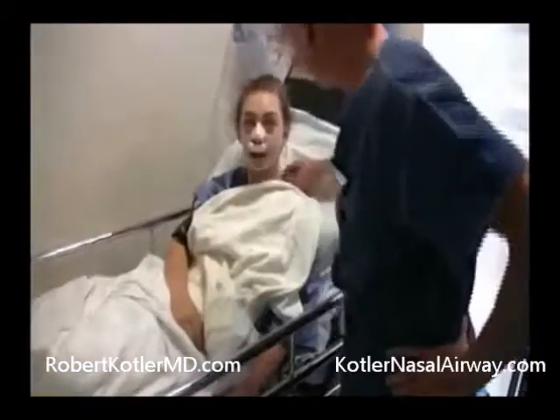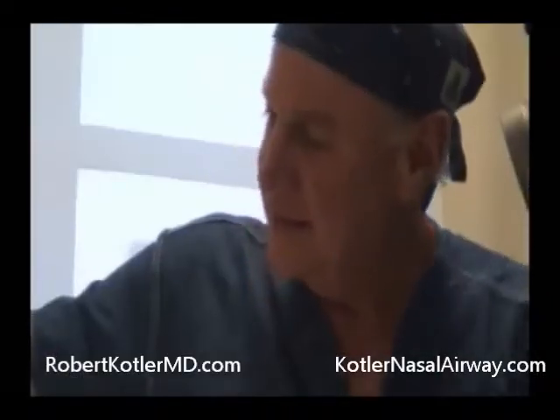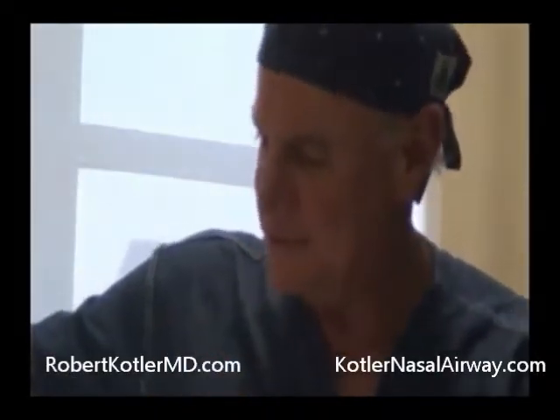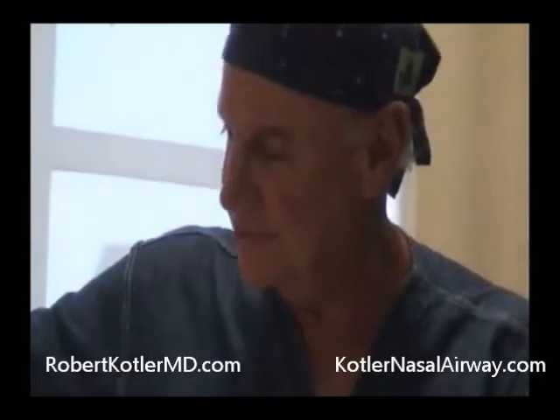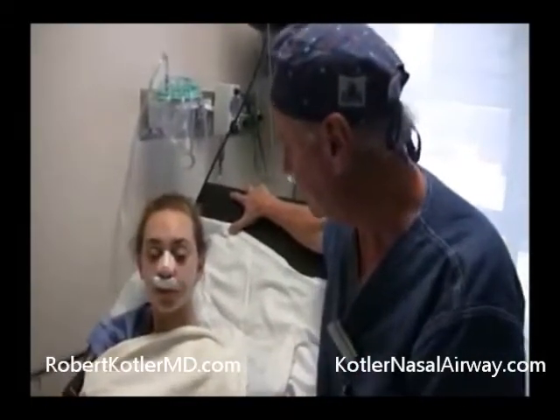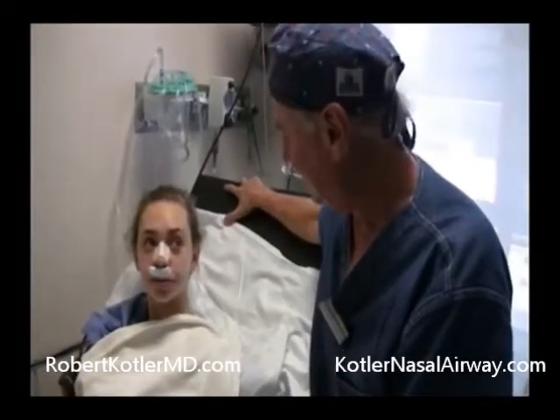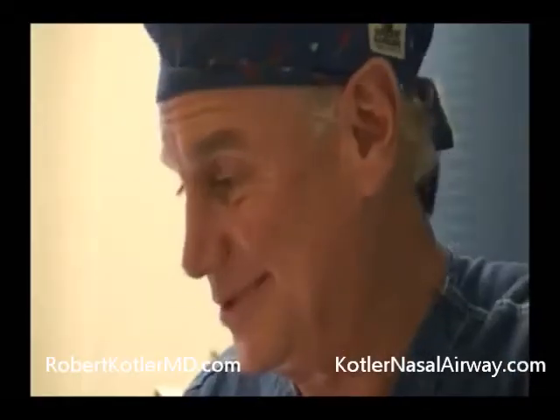No, she's fine. Everything's perfect. Good. All right? Feeling well? Good. Breathing okay? Good. Give me a little sample. So seal your lips and take a real deep breath through those tubes and back out. Seal your lips and take a real deep breath. And out. Good. That's good.